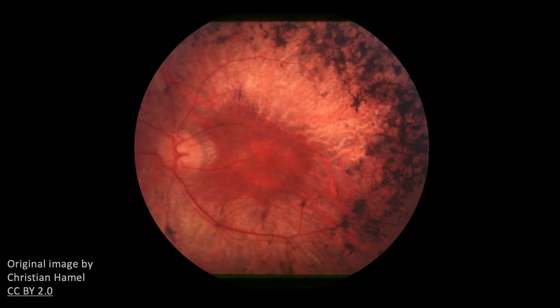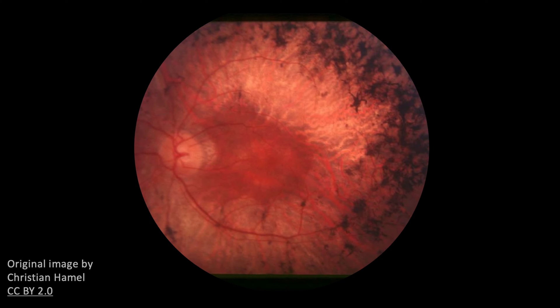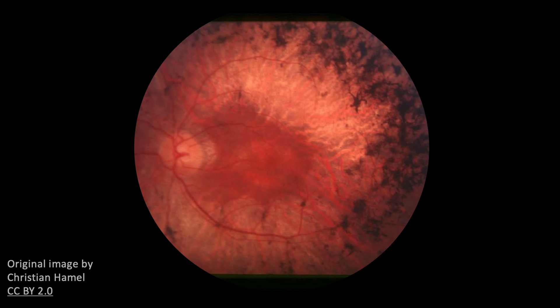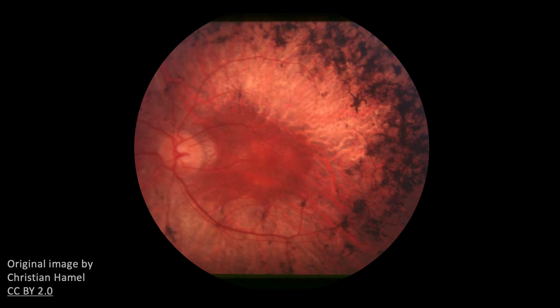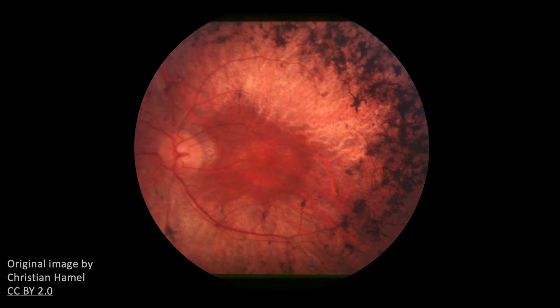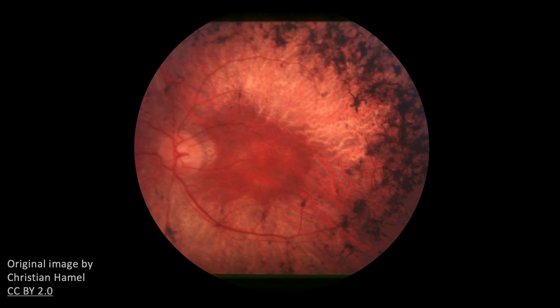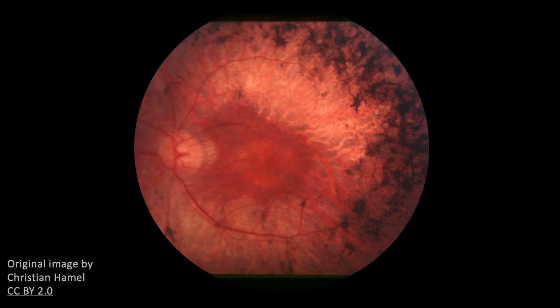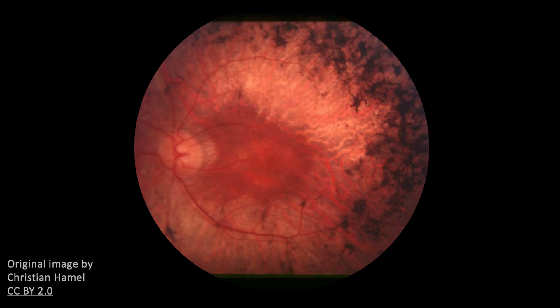In retinitis pigmentosa, perivascular bone spicule pigmentation results in a dark discoloration of the retina. Other characteristic findings include arteriolar attenuation and a waxy optic disc.